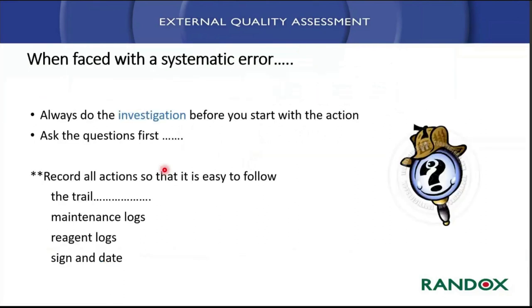A couple of slides just to finish. We could do a whole different section on troubleshooting, which we're not going to do today, you'll be glad to hear, but maybe next time we can do another session on troubleshooting. But it's really just to say, don't implement corrective actions without doing the full investigation first. The worst thing you could do is make a knee-jerk reaction without fully understanding what the root cause of the problem is.